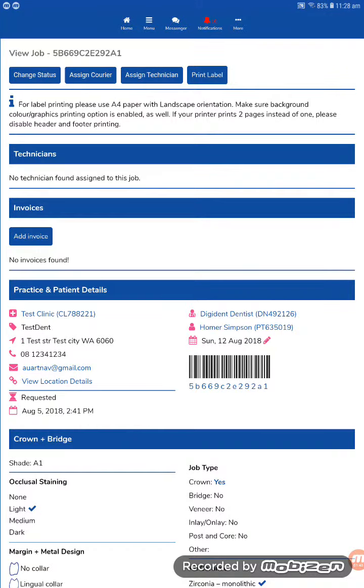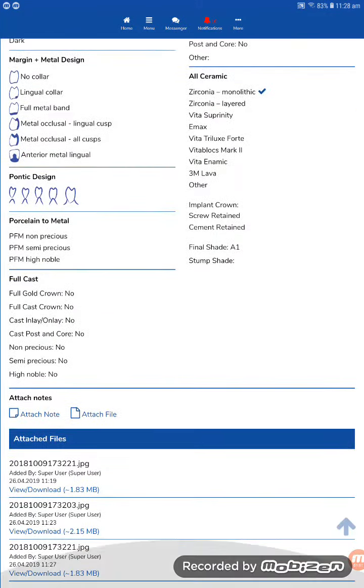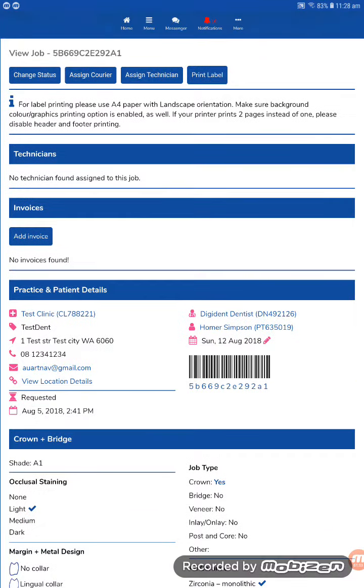So all information is kept and contained on the job form within the app. And it notifies everybody attached to that case of any updates, any changes that are made. So there's no more phone calls, no more need for chasing emails to send photos.